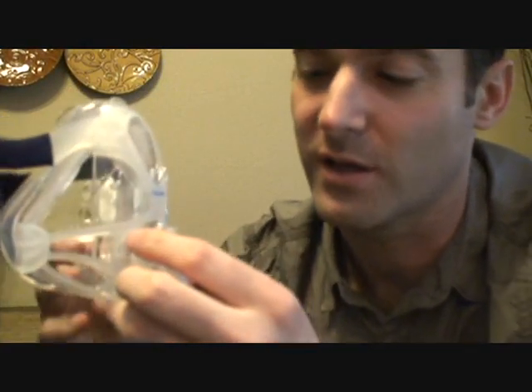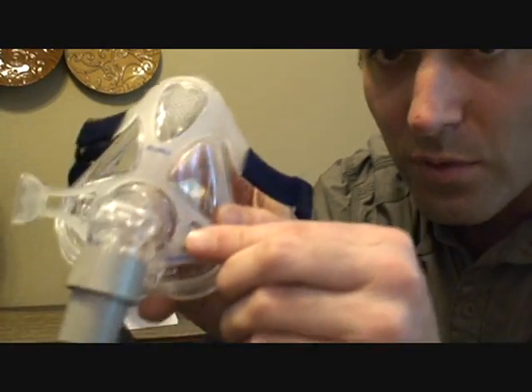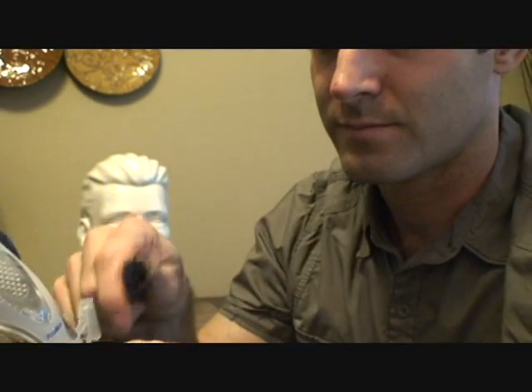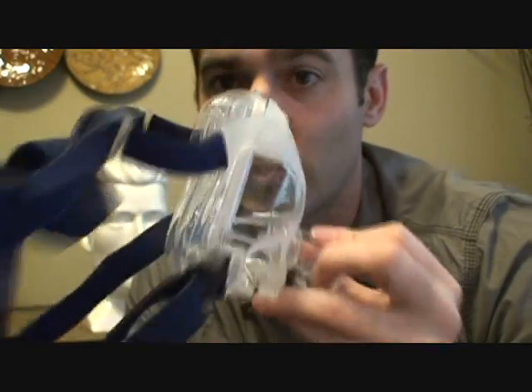Push this in until you hear some clicks — both at the same time. Then on the other side, pull this out to go around the tab. Once you hear it click into place, plug everything back in. Perfectly assembled and ready to go — one of the best full face masks in my opinion.